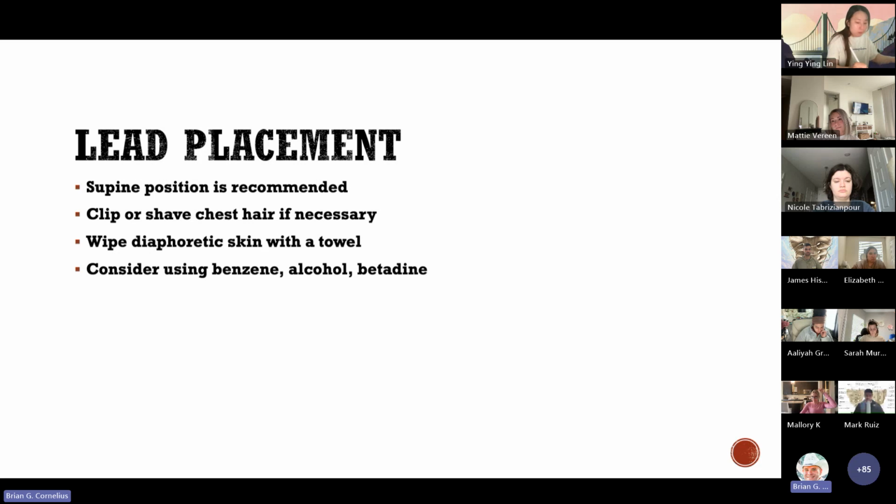Other things you may have to consider for patients, we're really considering really healthy patients for this, not necessarily people that have gone through traumatic events. So if you have somebody like a burn patient, you may have to consider using staples and alligator clips to actually be able to get the leads to stick, because if you've got tissue that's sloughing off, you may not be able to get a good viewpoint from that. So you really have to evaluate what's going on with the patient.